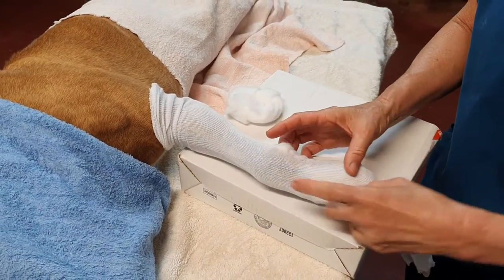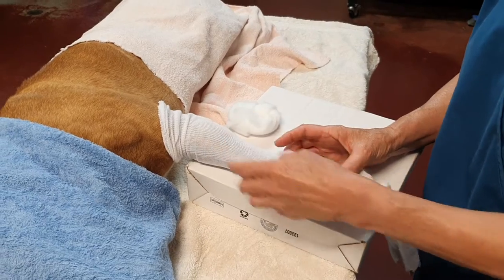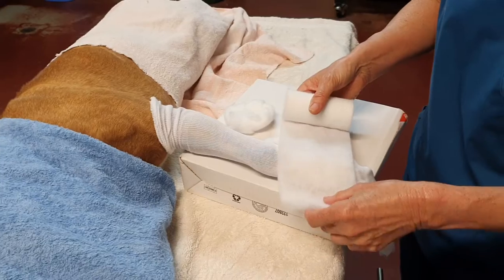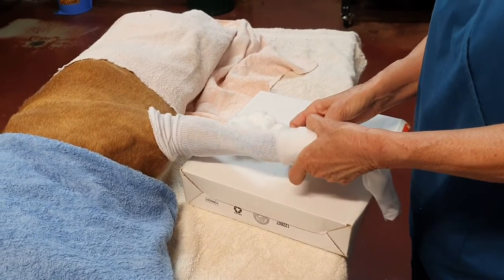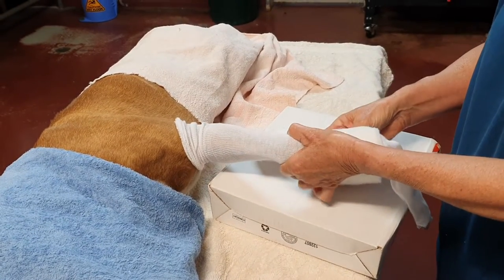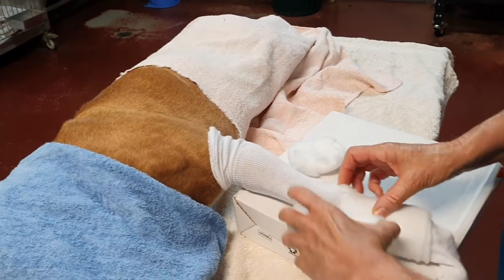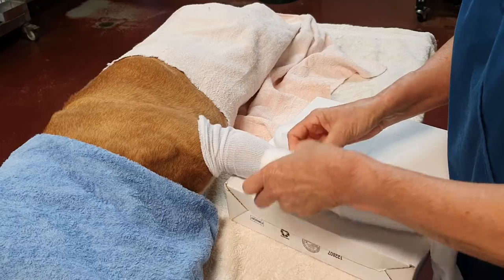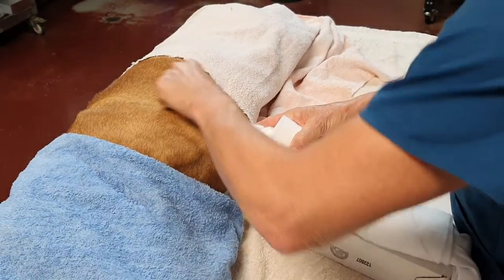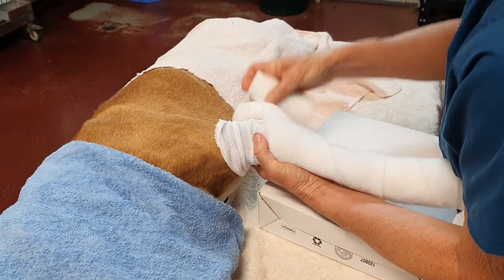When I go to splint him, I'm going to try and keep a 15-degree or just slightly tipped angle at his carpus, which protects the tendons. Let's now come over and start again with our conforming layer, holding those doughnuts in place at the same time. So two layers at the start, toes just here. I'm going to be overlapping this conforming bandage approximately 50% on itself on the way up.